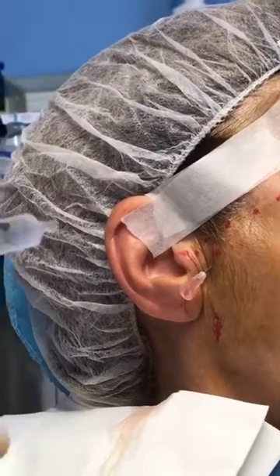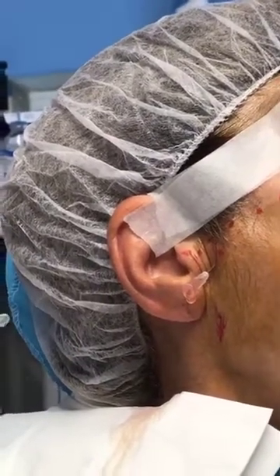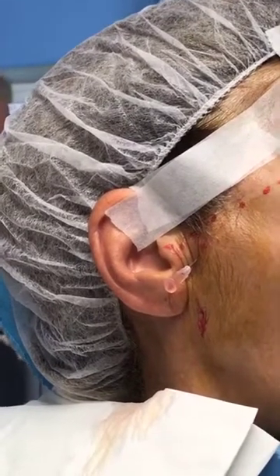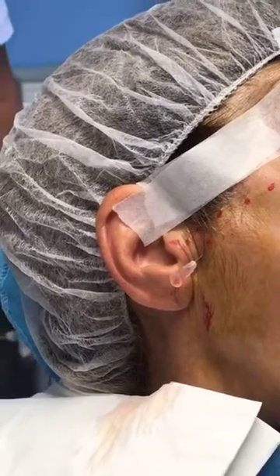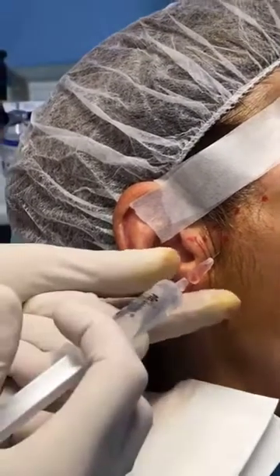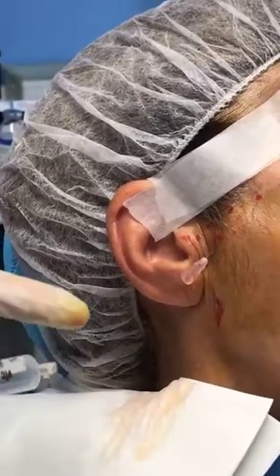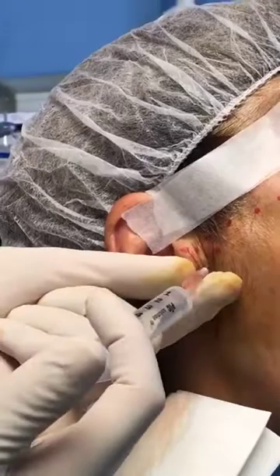As I said before, you can realize now that there is a great difference between a person having real advanced arthrosis, like the lady here, and the lady before who didn't have many problems with degeneration, but just dislocation and pain. Usually it's like this if you have a degenerated joint.